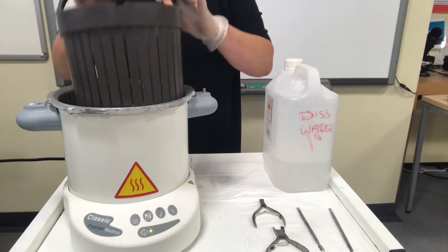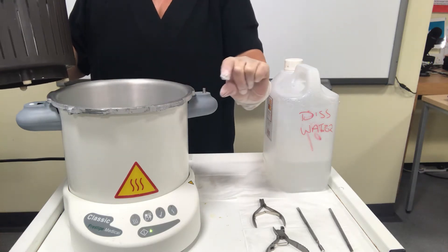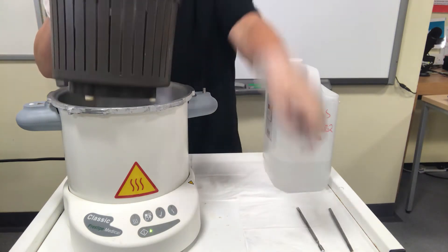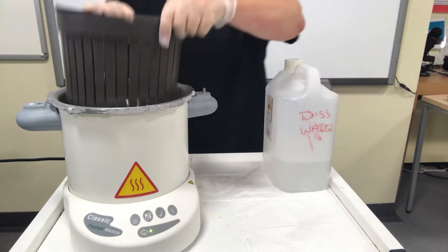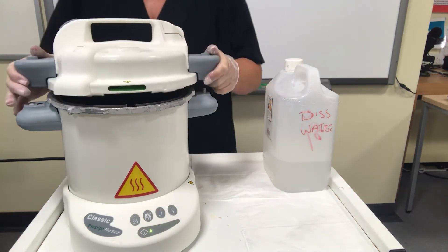Fill the autoclave to the level inside — it's about two centimeters. Then pop your metal tools into the basket and place the lid on top.